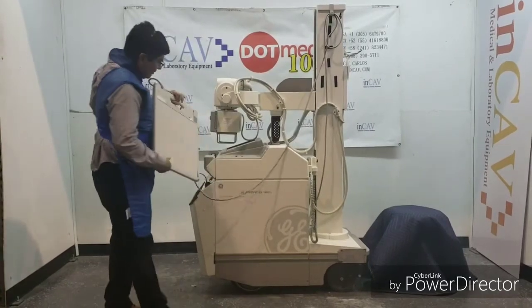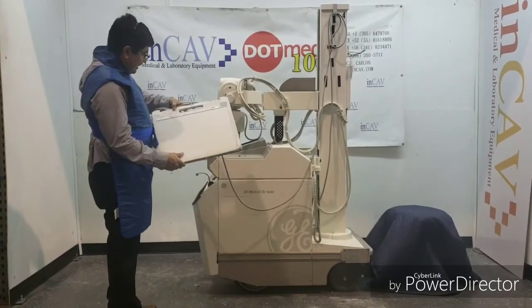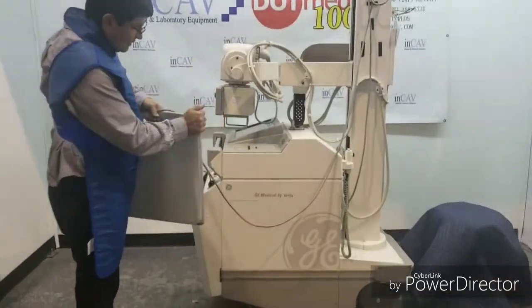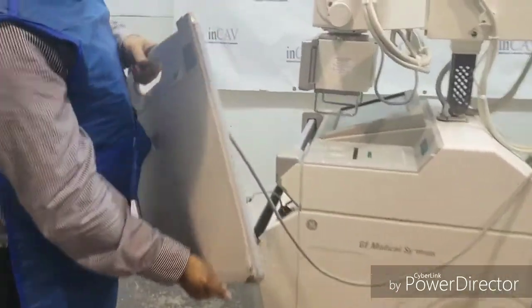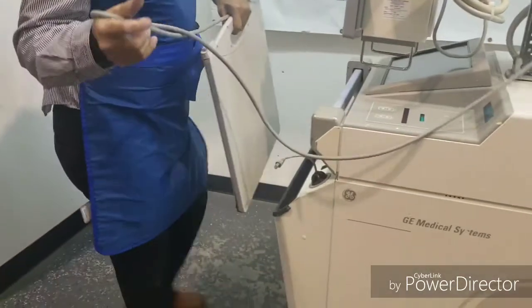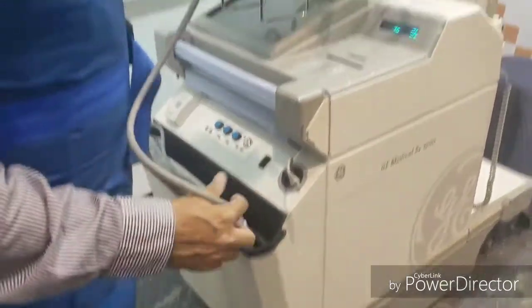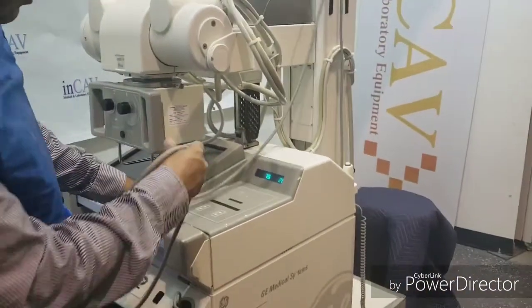It covers the Canon detector, the Canon XDI-55. It's a 14 by 17 detector. This is the case to protect the detector — very important. Always put the detector in the correct place. The cable never needs to be twisted; keep the cable loose.